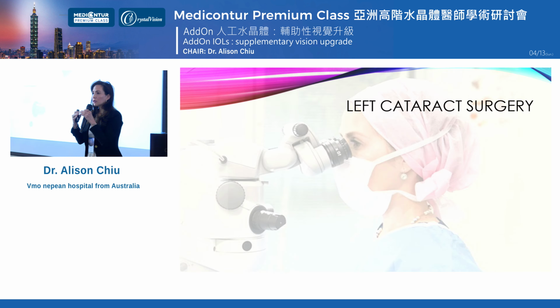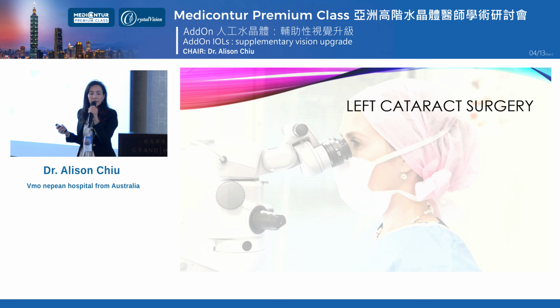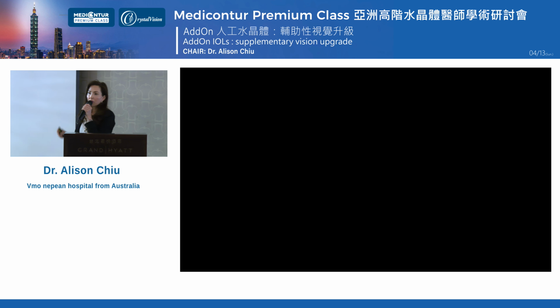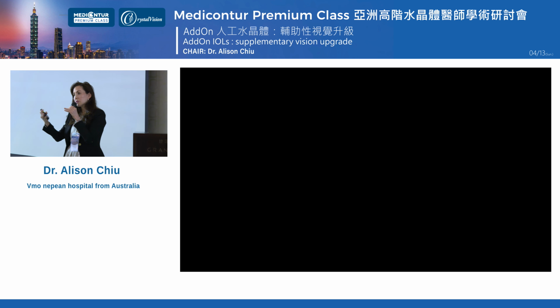Yeah, so the calculator, your local Medicontur rep, I hand the calculations off. I give my subjective refraction and the biometry, and my Medicontur rep takes care of the rest with the calculations. So there is a calculator, but I don't access it directly online. I give the information to my rep and they do the calculations for me. And they will give me sometimes a couple of options about choosing the final residual refraction, just like choosing a regular IOL. Thank you.